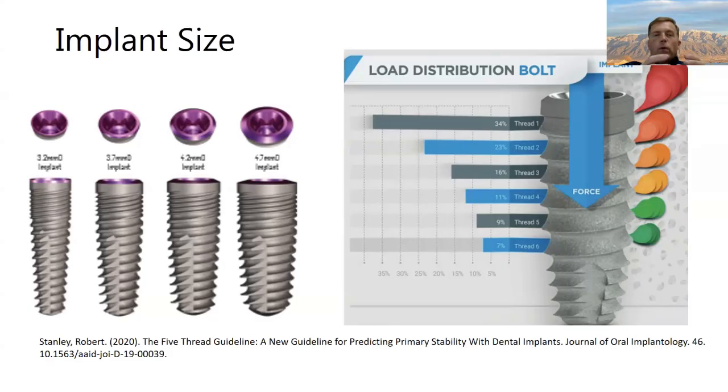When we use larger implants, especially larger diameter implants, we're lowering the stresses at the bone to implant interface, and again, creating a more favorable situation for our implants.